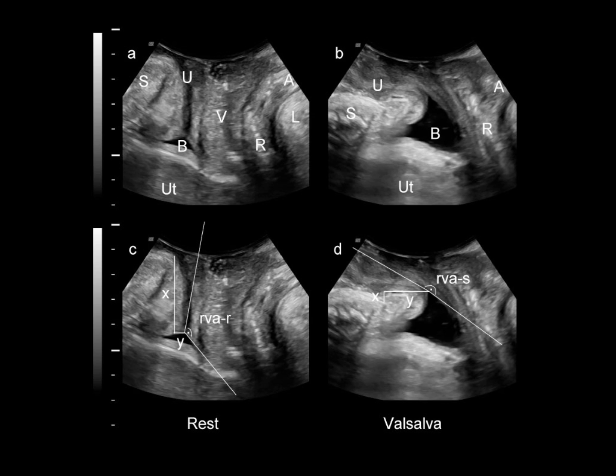So what's happened there is that the bladder neck has moved downwards by about 3.5 centimeters in that direction. Everything there kind of rotates around the symphysis pubis. The bladder neck opens up. The angle between proximal urethra and trigone opens up to 180 degrees. And I think you can pick up that there's some funneling there. This is what happens immediately before leakage.